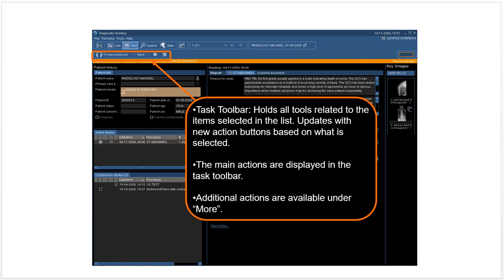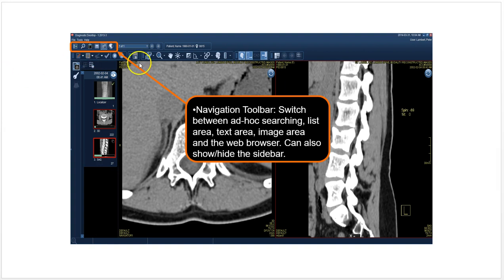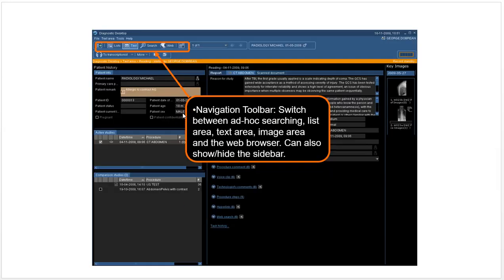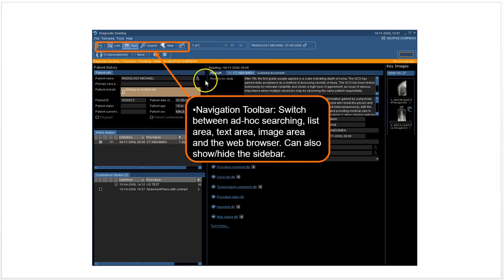Then you have the task toolbar, which allows you to do different things with the reports. You can send it to the transcriptionist to be reviewed, other things like that. The navigation toolbar we talked about already—it's just here you have the navigation toolbar with images up. This is the image window.